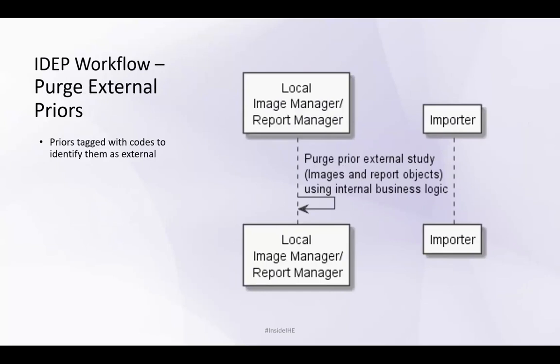IDEP also defines a purge workflow for priors and reports. So all the external data is tagged in such a way as to make it easy to identify as external data, and then the profile has suggestions on how this can be tied into lifecycle management to avoid having to store external data indefinitely.